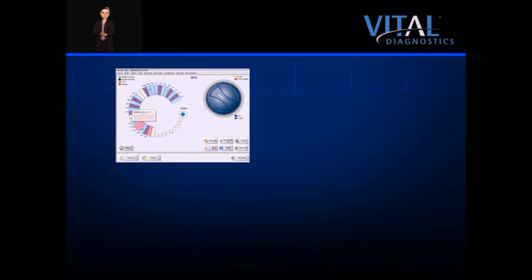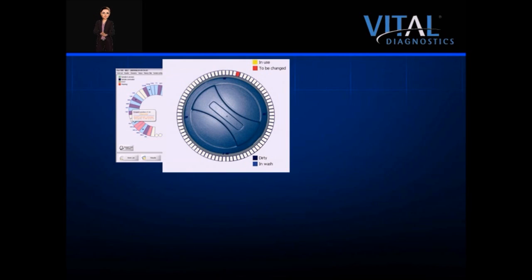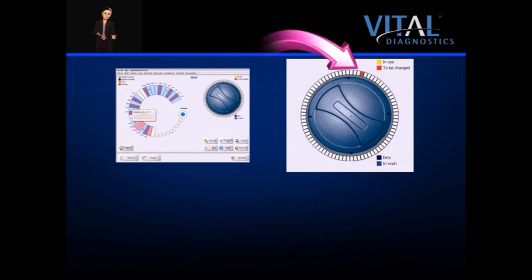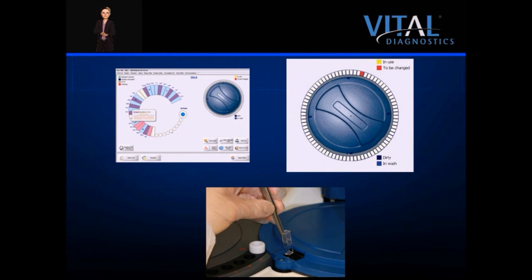The status screen displays cuvette status prominently. If a cuvette fails an optics check, it is re-washed and re-checked. If it fails again, it is flagged to be changed and avoided by the software. Cuvettes can be individually replaced with the special tweezers supplied with the instrument.